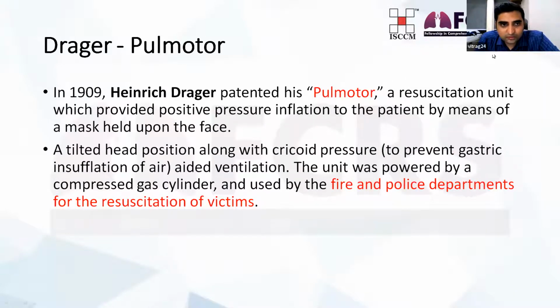So the actual ventilator of Draeger started with the Pulmotor in 1909. Heinrich Draeger, the inventor of the Draeger company and Draeger ventilator, patented his first ventilator with the name Pulmotor. So this was the first positive pressure ventilator device.